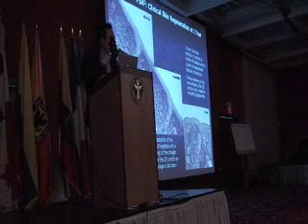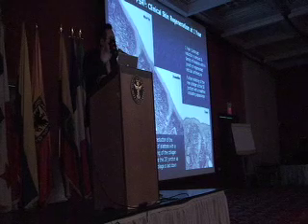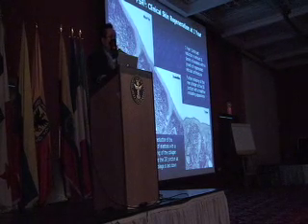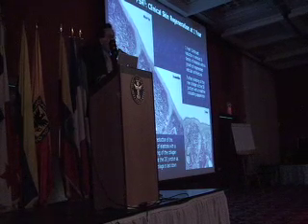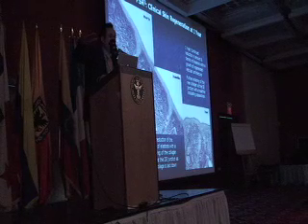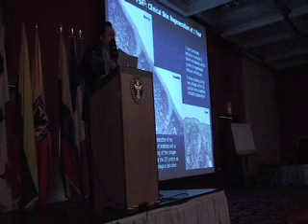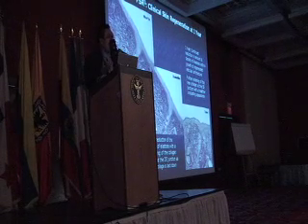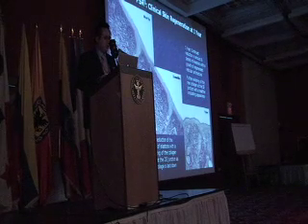You have to educate them that at a high setting, or even a low setting, that collagen remodeling takes a long time. Especially at a low setting, because at a low setting, at PSR1, you don't get that outer layer skin change immediately like you do with a high setting. You're waiting for that modification, that deeper collagen to occur. That takes months. So handhold the patient through that period of time that you have to wait for those changes.